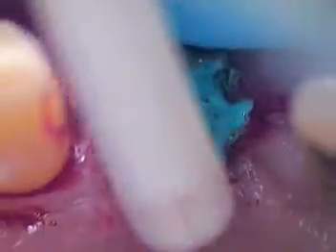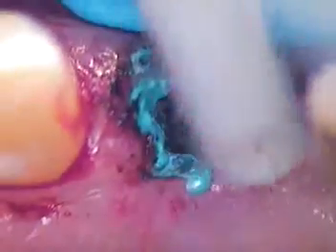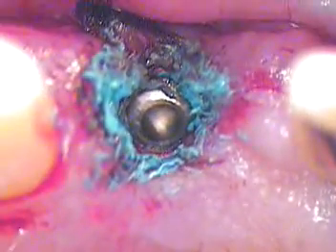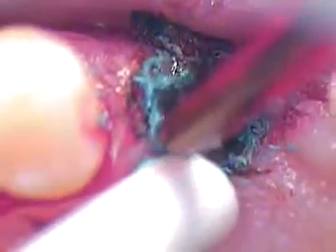Okay. Go ahead. Good. That's good. Alright, cavity cleanser. Suction that thoroughly. So we're getting the cleansing action of the cavity cleanser.